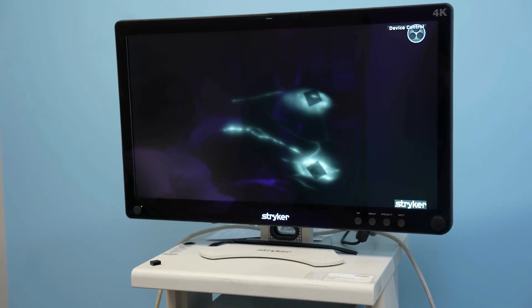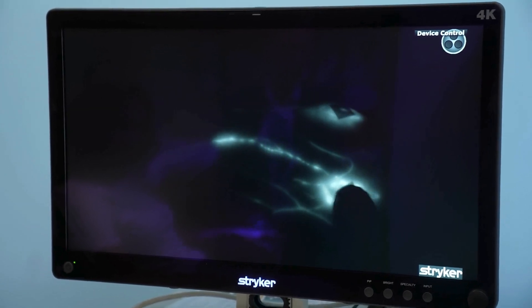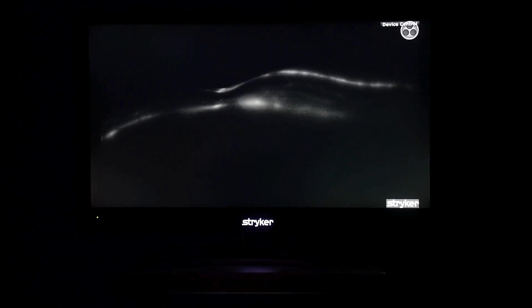You can immediately see — this is the unaffected arm — the lymphatic system. You can turn the lights and you can see these lymphatics go all the way up, and there's the axillary lymph node right there. If you carefully look, you can see these lymphatics move on their own. They pump several times a minute.